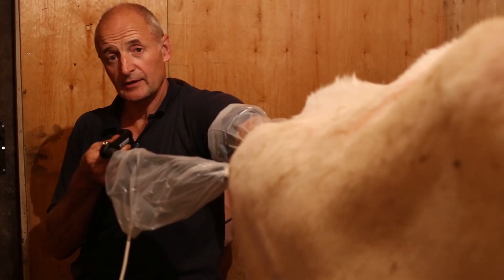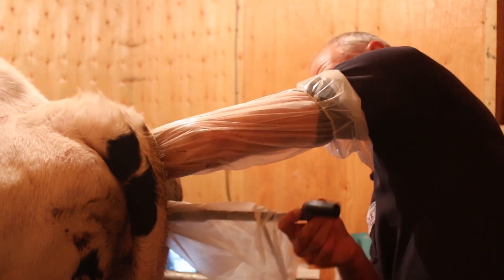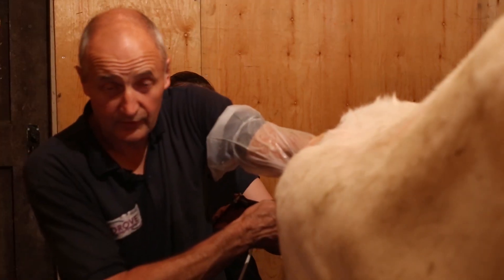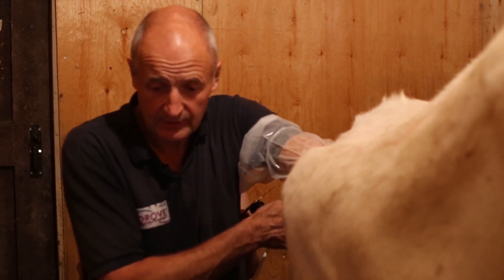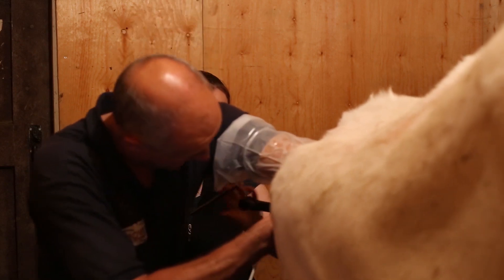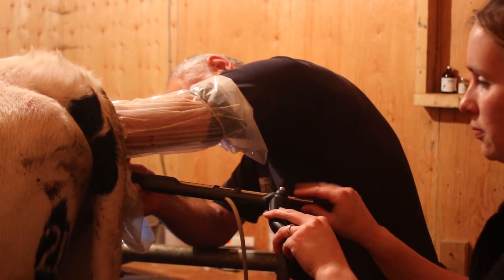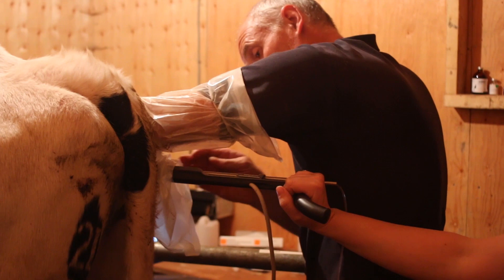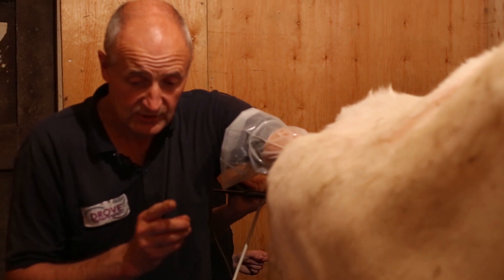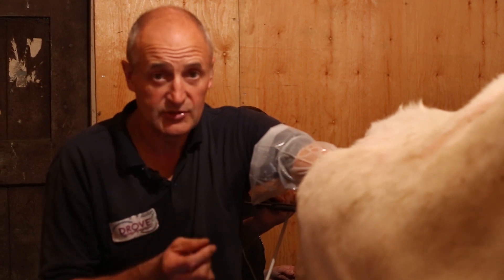The probe has been designed with a nice handle that my assistant can hold in place firmly, opposed to the ovary, without getting in the way of the needle holder as it goes in and out. I've got her right ovary in my hand, always starting with the right-hand side, and I've got the probe firmly into the vagina. Ros has got hold of it, and now we're going to introduce the needle through the needle guide, gently pushing so the needle emerges right next to where the probe is. I can clearly visualize the needle going inside the follicular structure, sucking out the follicular fluid and hopefully the oocyte that we need to collect.